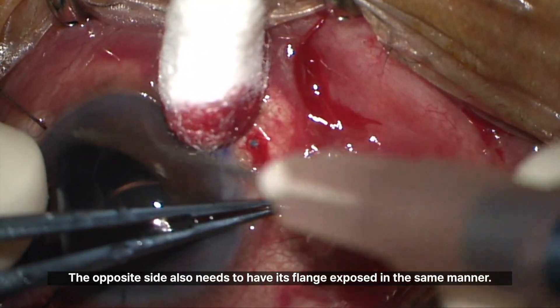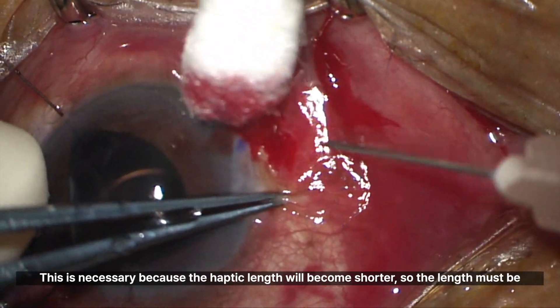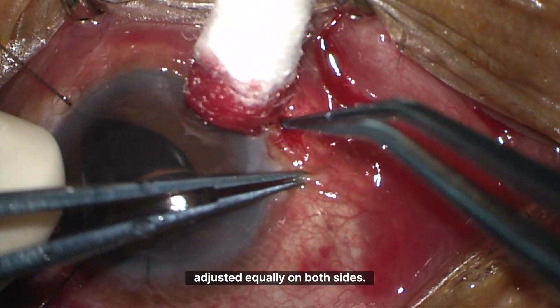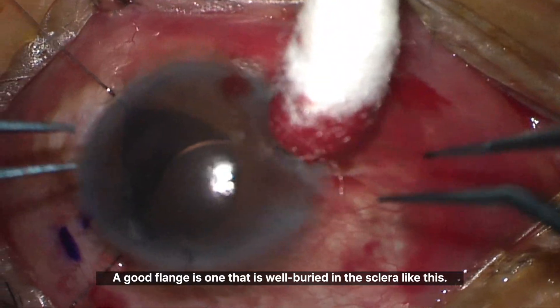The opposite side also needs to have its flange exposed in the same manner. This is necessary because the haptic length will become shorter, so the length must be adjusted equally on both sides. A good flange is one that is well buried in the sclera like this.